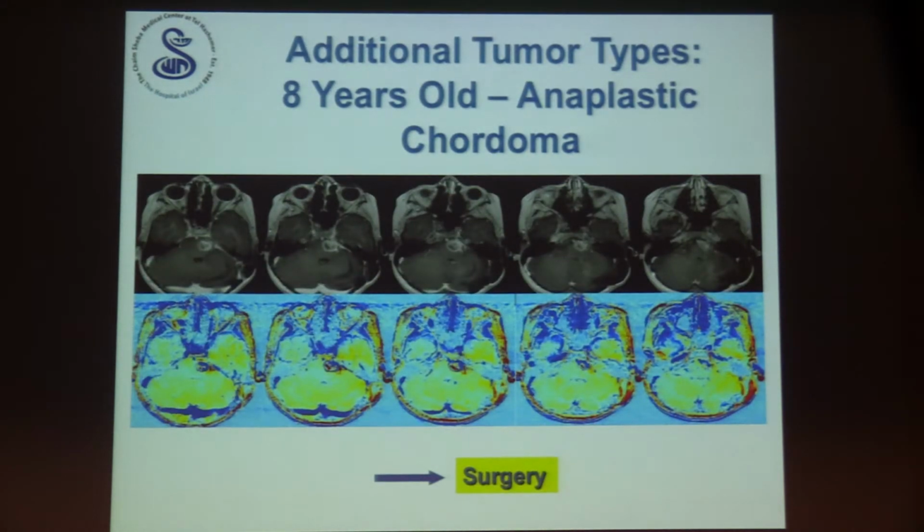Regarding children, we never did a study on children, and we expect that the delays there may be different. The delays that we have determined to be good for diagnosis of adults, as you remember, is 5 minutes, the first time point at 5 minutes post-contrast injection, and the other one at least 1 hour later, between 1 and 2 hours. So for children, it probably would be different, and anesthesia may also affect this timing. We have never studied it.